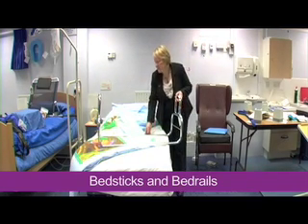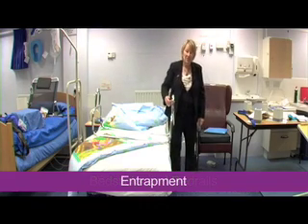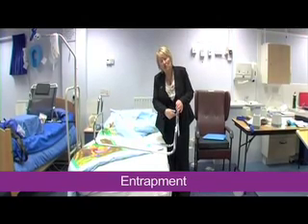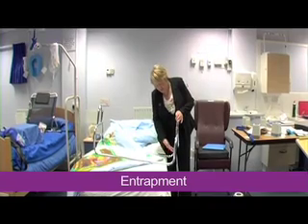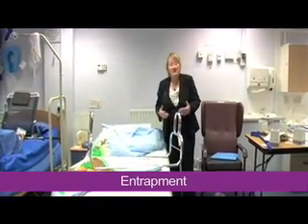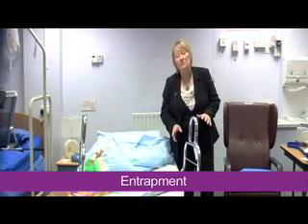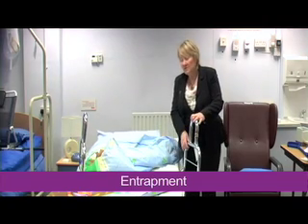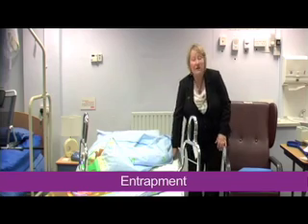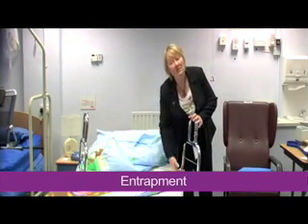I can't stress enough how important it is that you have assessed the mattress and the client. This gap between here is a regulatory gap, right? Because there have been fatalities where people have managed to get their head or a limb through here, and also their head between this bar and the mattress. If a mattress is particularly squashy, if you think of somebody who's got dementia or somebody in their sleep just doing that, they can get underneath here. So you really do need to risk assess every single assessment that you do and every provision. If I'm considering issuing something like this, you need to know about the client, the activities of the client. You need to make sure that the mattress, for instance, isn't too squashy. And when it's fitted, you do need to make sure that you're happy that no entrapment can happen.